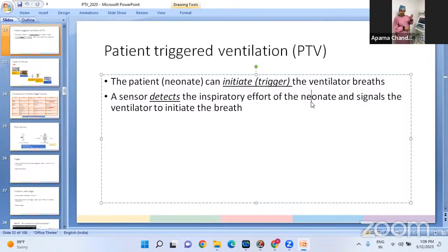So for the I time, the ventilator will be delivering higher pressure or PIP, so it is more completely occluded. For E time, the expiratory valve is partially occluded and hence it delivers PEEP to the patient.